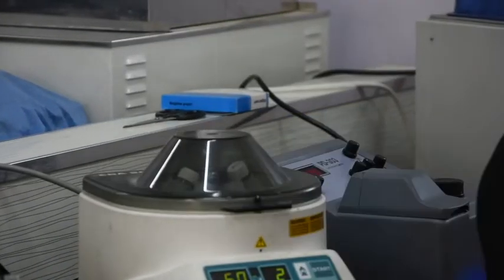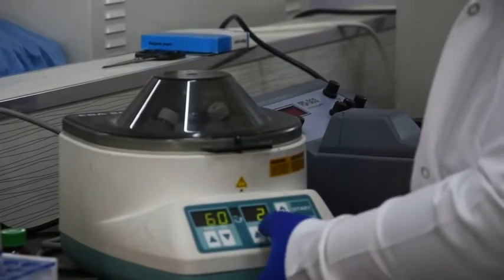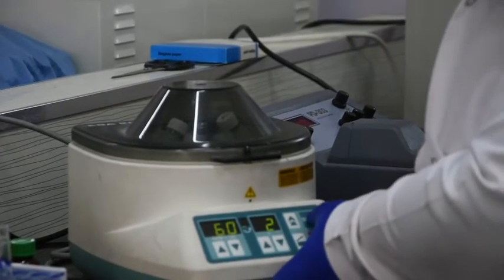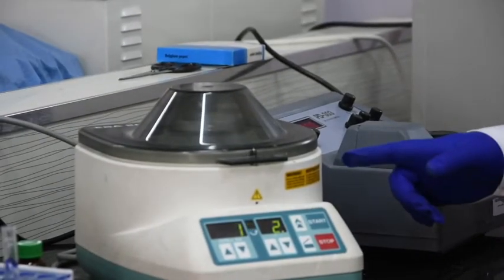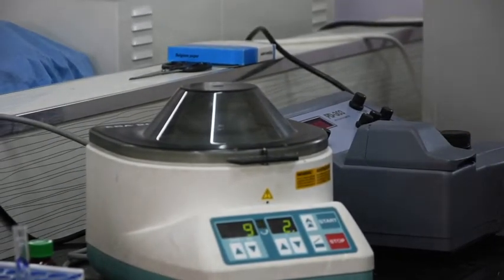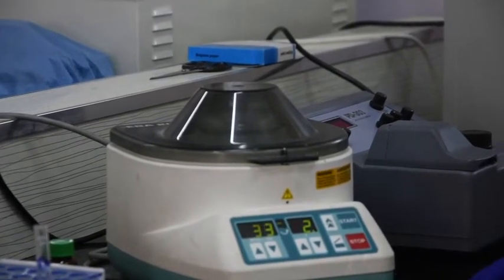Cover it, and we need 6,000 rpm for 2 minutes to spin in the centrifuge. You see, we have 2 minutes to finish it.